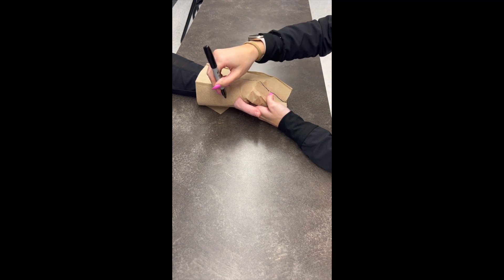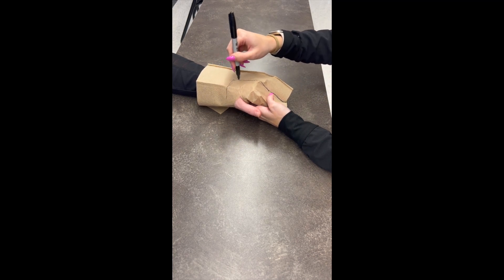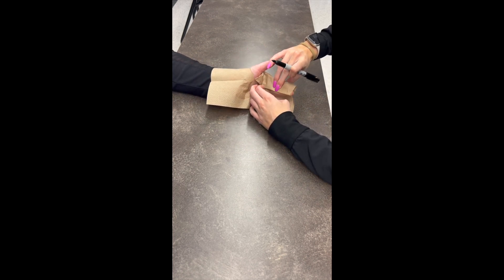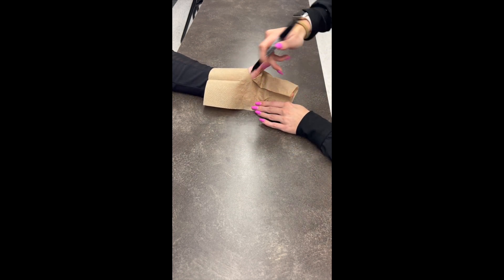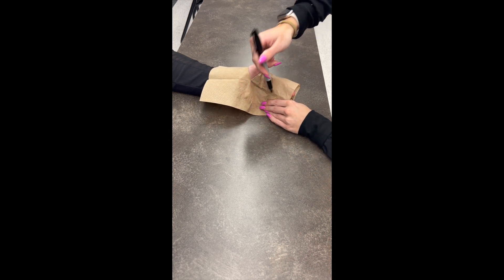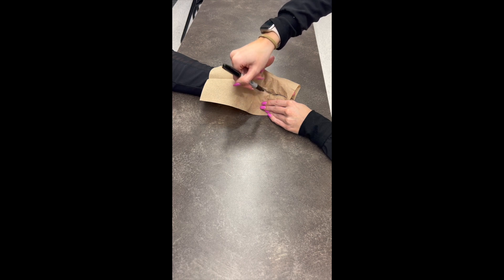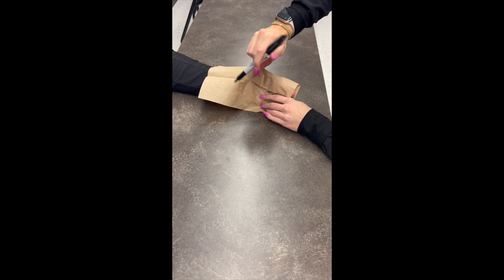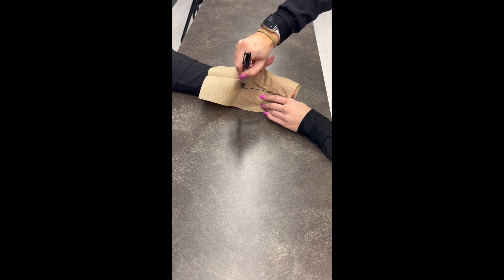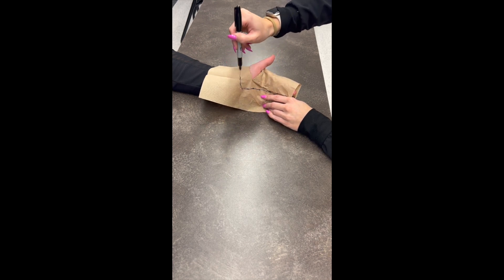Then we're going to mark at the wrist. For the volar side, we're going to do the same thing — palpate between the middle and ring fingers, then mark at the base of the thenar eminence and around the wrist.